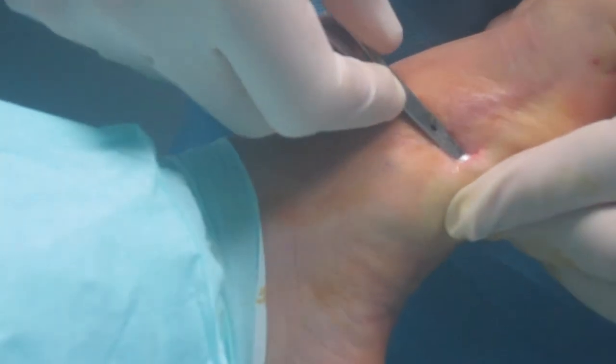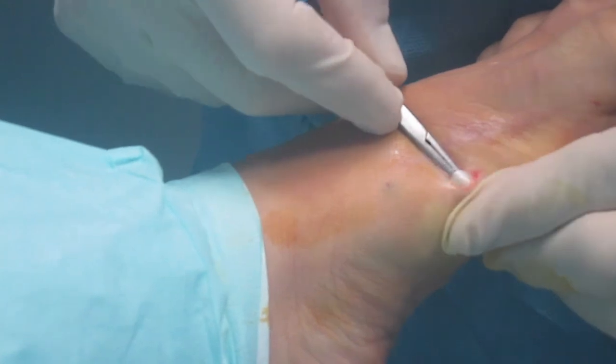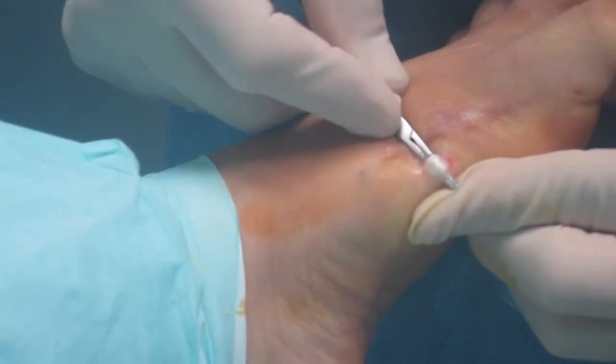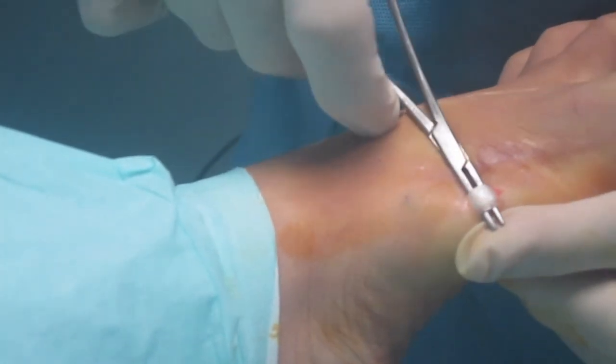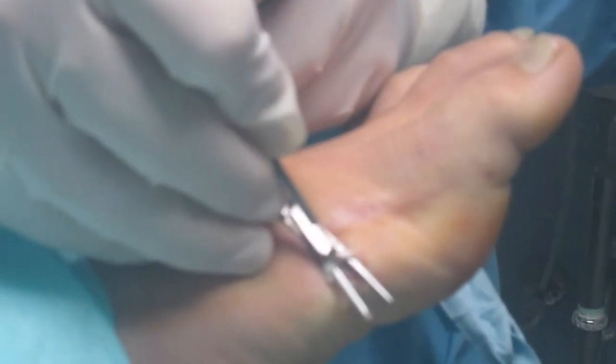Once you make the incision, you take a straight hemostat, you're going to fish out your tendon, and you see the tendon structure coming through the surgical site now. So that's our abductor hallucis muscle tendon structure. Once you have that out, it's ready to transect. Okay, to transect the muscle or tendon structure, all you do is you take your 15 blade and go ahead and transect that out. So you've made a tiny incision here. Look at the big toe. You can see it already kind of going back lateral. See how it went back lateral?